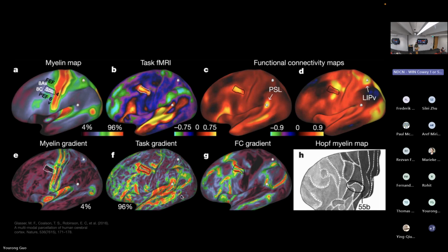You can also view them very clearly if they are marked using the metric gradient, and this helps you to identify these kinds of parcellations. And there are also a lot of other areas defined in this way using the comprehensive knowledge.